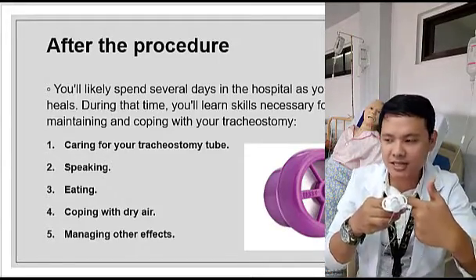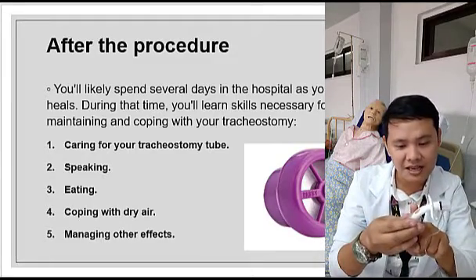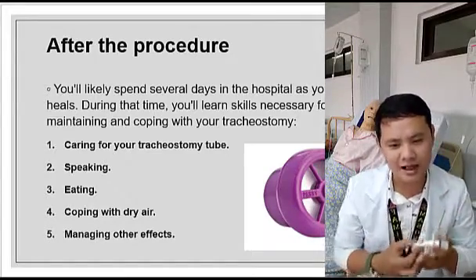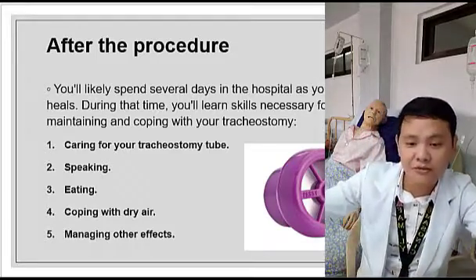Pero kapag ka magsasalita ka na, magko-close po yung valve, so ang hangin ay lalabas po dito sa may fenestration or dun sa may hole. So meaning to say, ang hangin ay lalabas po sa may bibig at saka sa may ilong. Mas makakapagsalita ka. Okay? So yan yung purpose nitong valve na to. It will become easy for you to speak.